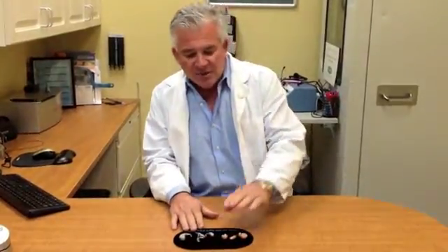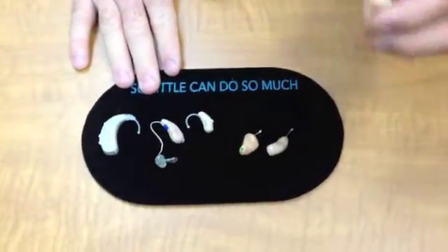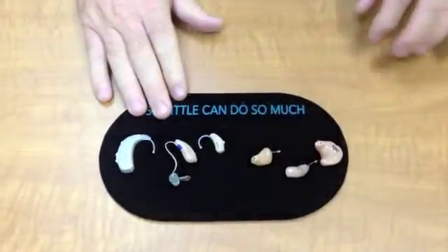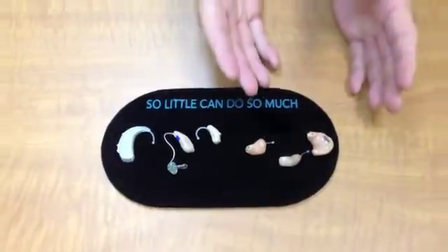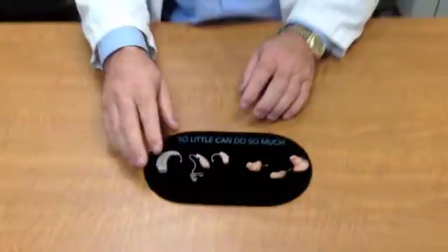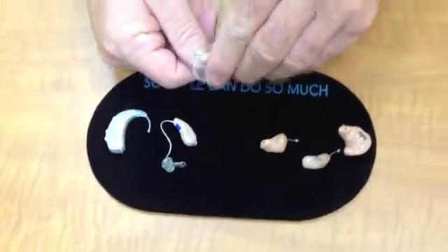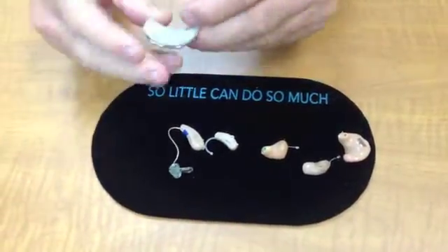As you can see, on this side we have what we call our custom instruments. You can see they have different sizes. We have the really big jumbo guy here, a smaller one, and then a medium-sized one. We actually have one a little bit smaller, but I don't have a mock-up of it because it's so small you can't see it. And then over here we have a behind the ear. We have the little teeny guy. I mean, look how tiny that little guy is. And then our medium-sized and our really jumbo-sized guy again.